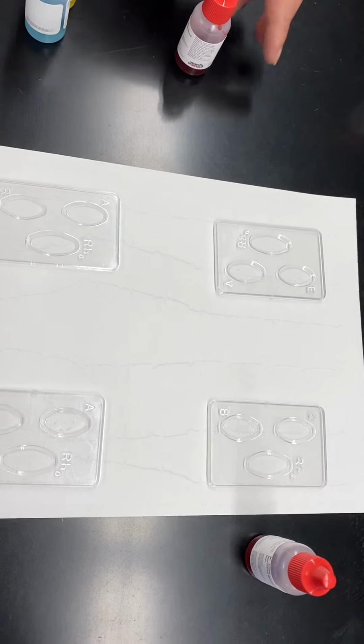So here what I have is 4 blood samples. If you read this, it says Mr. Green blood sample. This one says Ms. Brown. We have a sample for Mr. Jones, and then another sample for Mr. Smith. Basically what this means is we have 4 samples from 4 people, and we have no idea what this blood type is going to be. As you can notice, we have 4 trays, and we're going to use these trays and our original blood type and what you have here to identify the blood type.